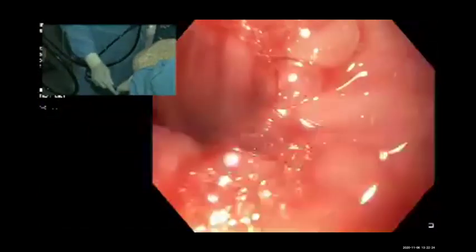Is there any issue if you do a transesophageal puncture, of irritating the diaphragm or going through the diaphragm? No, that is not a big problem. The only thing is if the esophageal varices are big, then you should avoid transesophageal. Otherwise, your stability is more in the esophagus. I would have tried in this also. Okay. So any question, anything, I will be happy to answer.